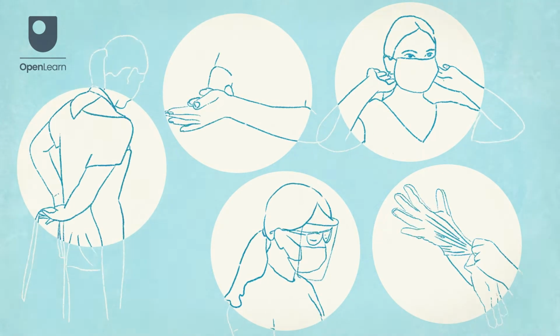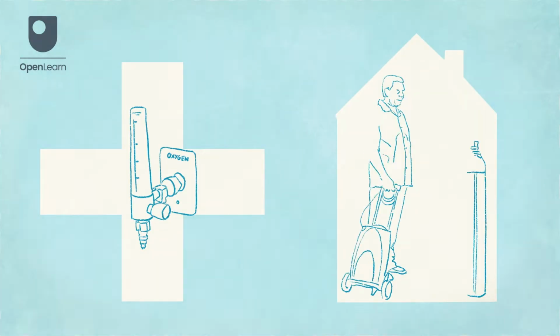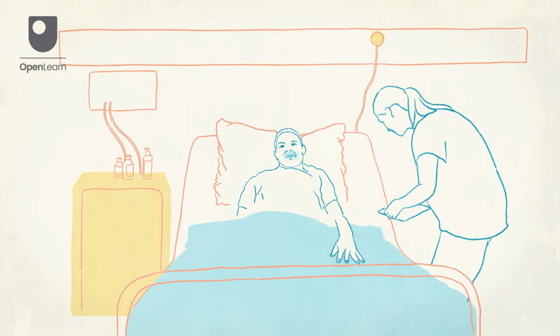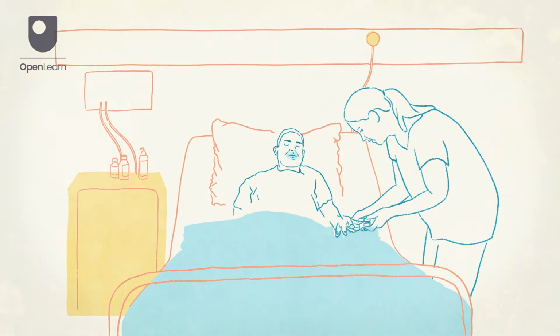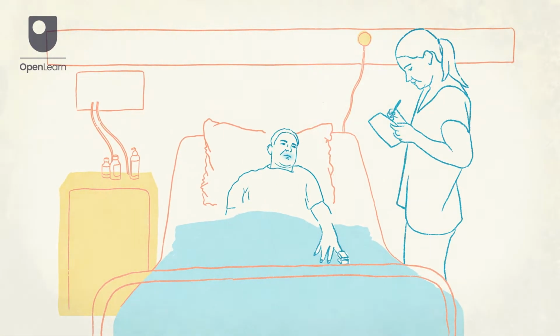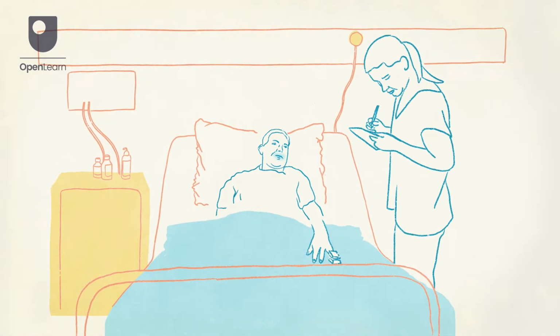Oxygen can be administered in different healthcare settings, acute and long-term, including in the person's home. The oxygen prescription should set parameters for the method of administration, the amount to be given, and the target oxygen saturation levels. The ability to wean the oxygen as the person's needs alter is important.